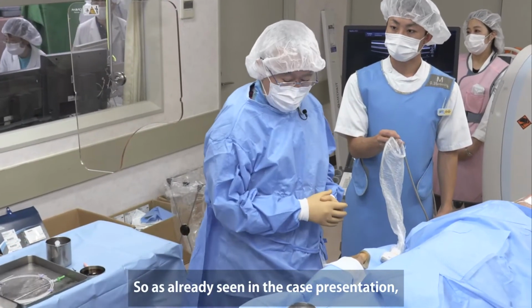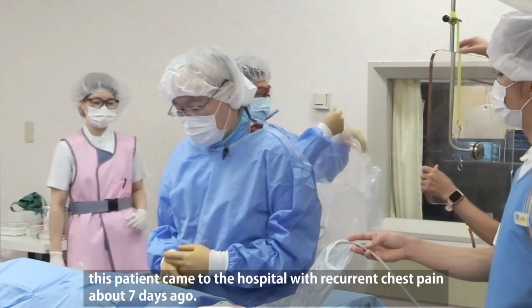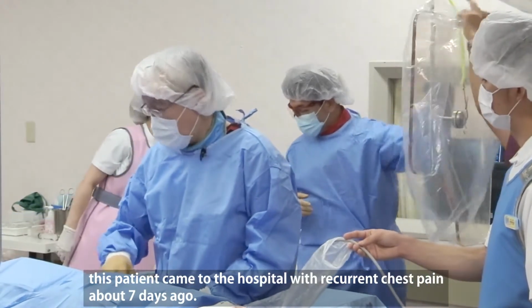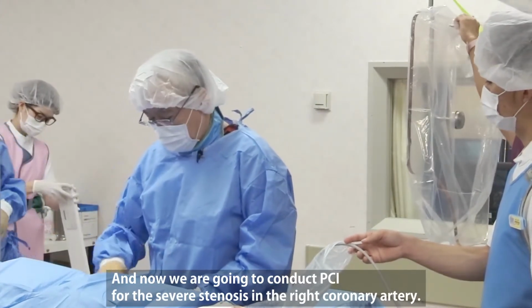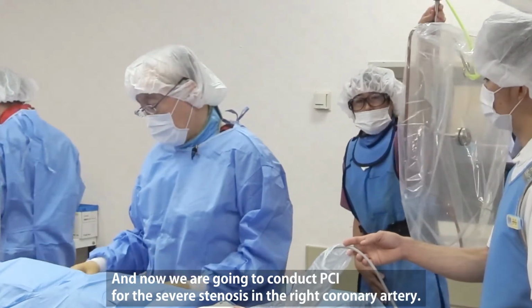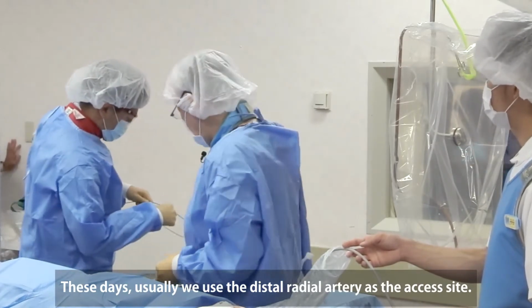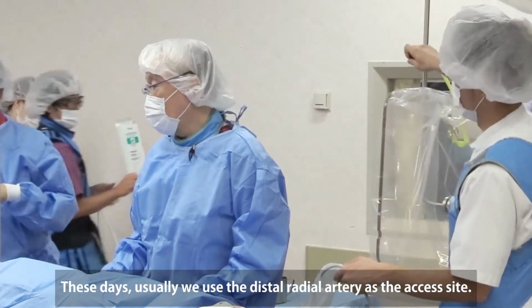So as you already saw in the case presentation, this patient came to the hospital with recurrent chest pain about 7 days ago, and now we are going to conduct PCI for the severe stenosis in the right coronary artery. Usually, these days, we use distal radial artery as an access site.